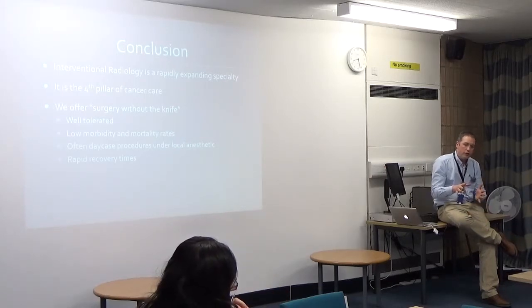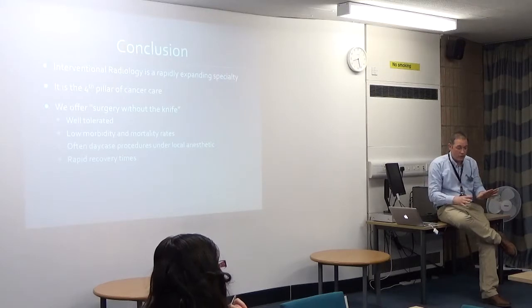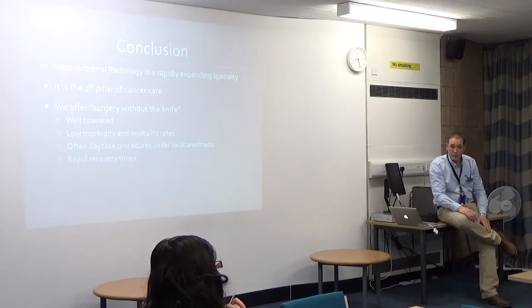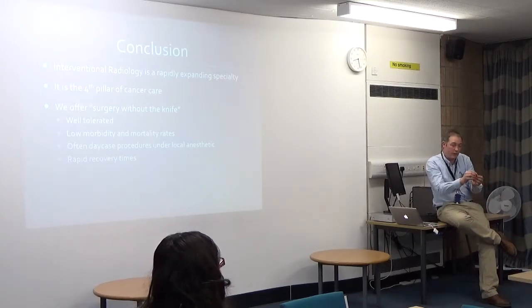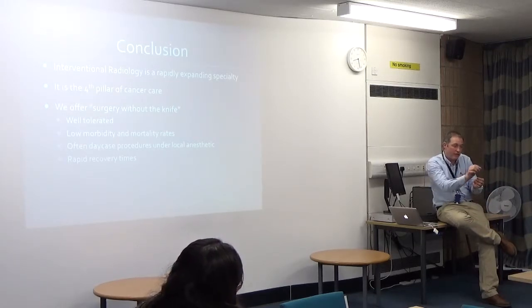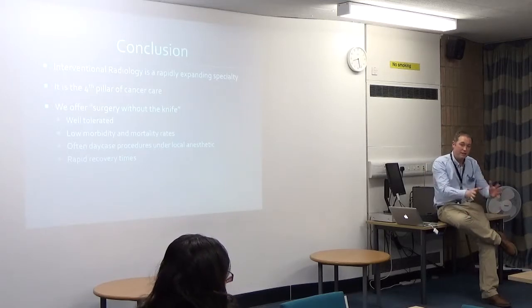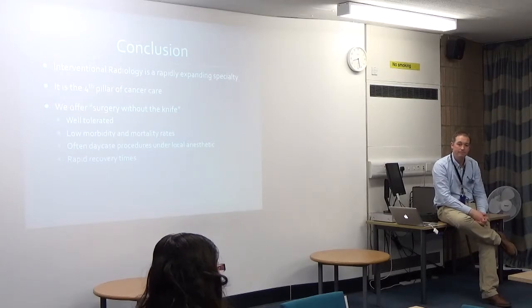The tubes, we only use as guides really. So the tube is just a plumbing thing, like a body plumber. The little catheters, we call them, are just there to negotiate to get us to the place we want to be to do something. So the tubes are only there for a few minutes, and then we do the treatment. Through the tubes we'd inject these little beads or what have you. And then once that's all done, everything comes out. The tubes come out. They're only there to take you to the place you want to be to do the job in hand.